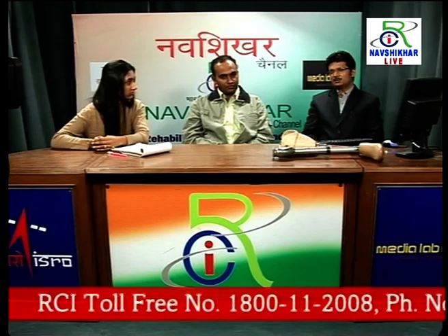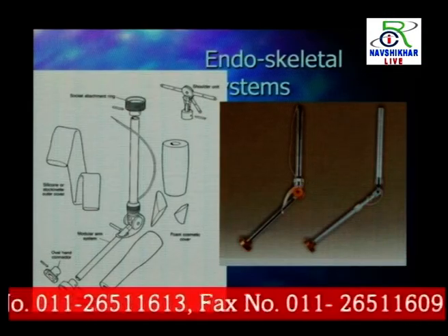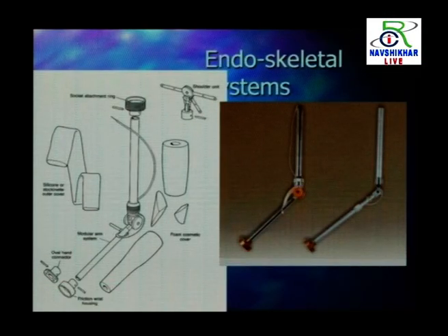In the modular concept there are different types of modules. For example, for an upper extremity prosthesis, the basic component will be the socket. That socket is fabricated inside the workshop according to the need of the patient. The measurement is taken, the cast is taken, then modifications are done, then the socket is made. Then all the components like pylon, joints, and hand are assembled according to patient need. They come from different companies, and interchangeability of components is also possible.